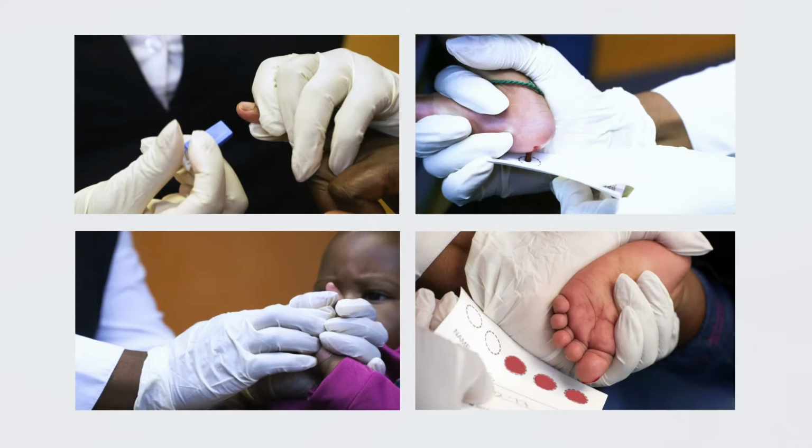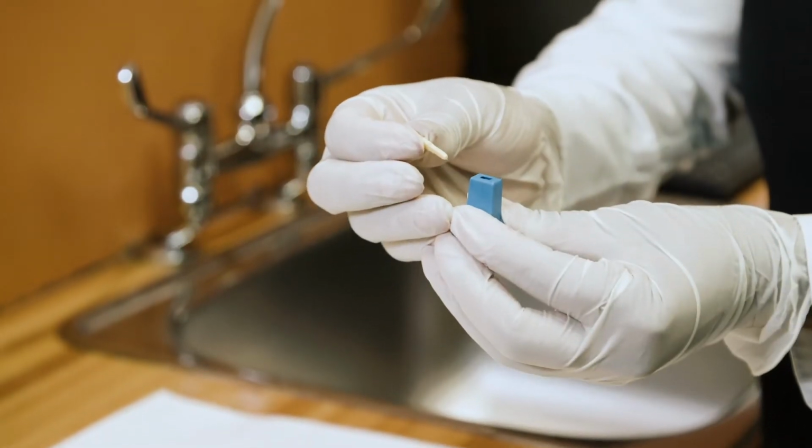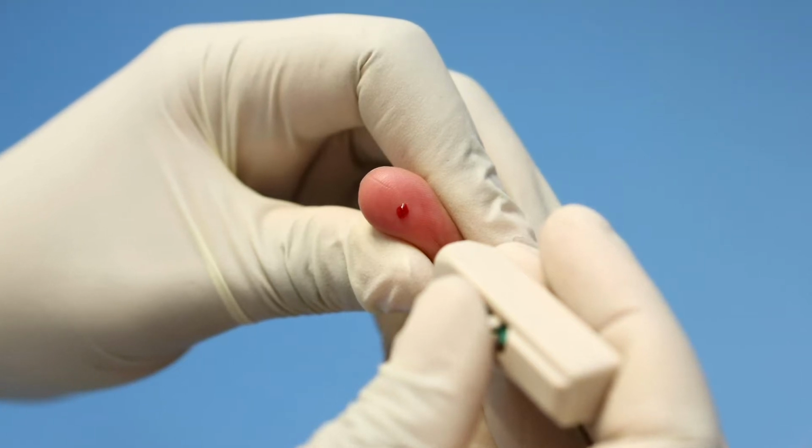Regardless of the age of the patient or location from which the sample will be collected, the preparation steps for collecting the sample will remain the same.